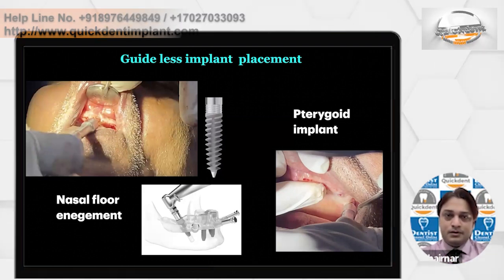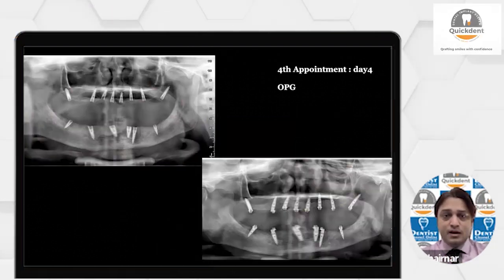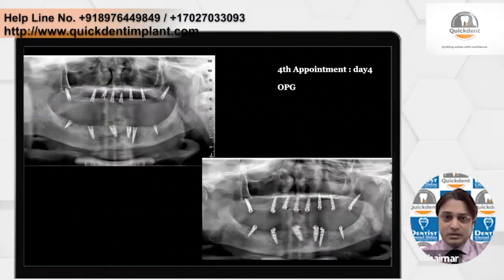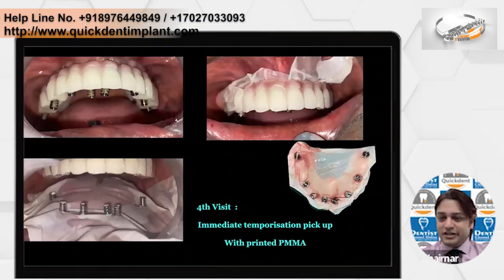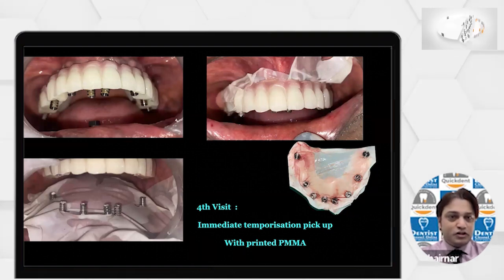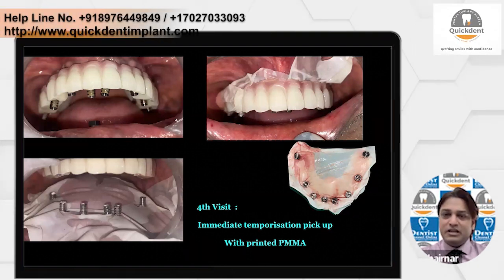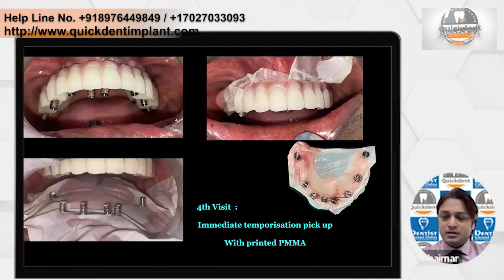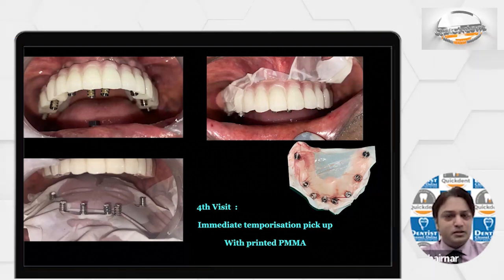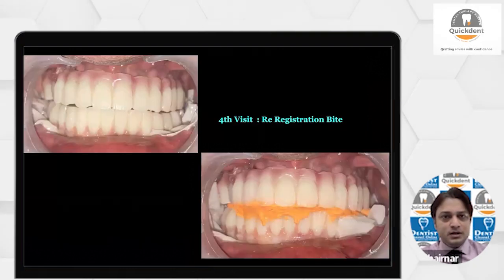And this is the X-ray of the patient, with multi-unit attached on the same appointment. Our shell is already ready. We will put the titanium cylinders, also called temporary cylinders, and we will make a hole and catch the position of the temporaries. It is done. That is how you do the conversion of the normal dentures. I think many of you must be knowing about this.